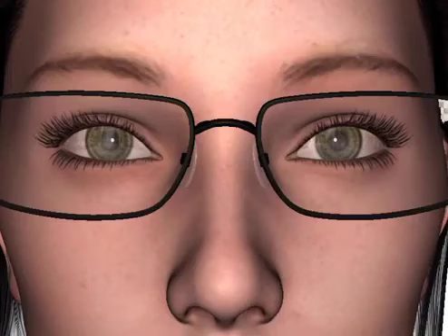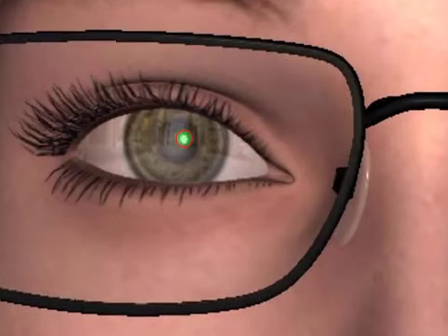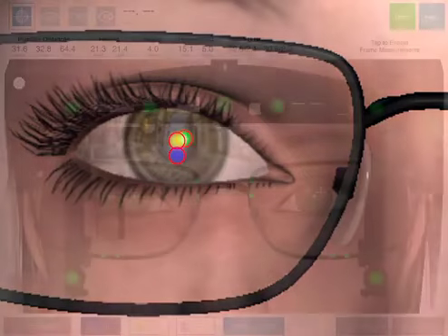When comparing the app's fitting heights to manually obtained ones, please ensure that the same measurement reference points are being used. First, establish what manual reference points are currently being used in your practice. Common reference points are the corneal reflection, pupil center, and a few millimeters below the pupil center. Additionally, due to human eye bias, many opticians that believe they dot center pupil consistently dot below the pupil.